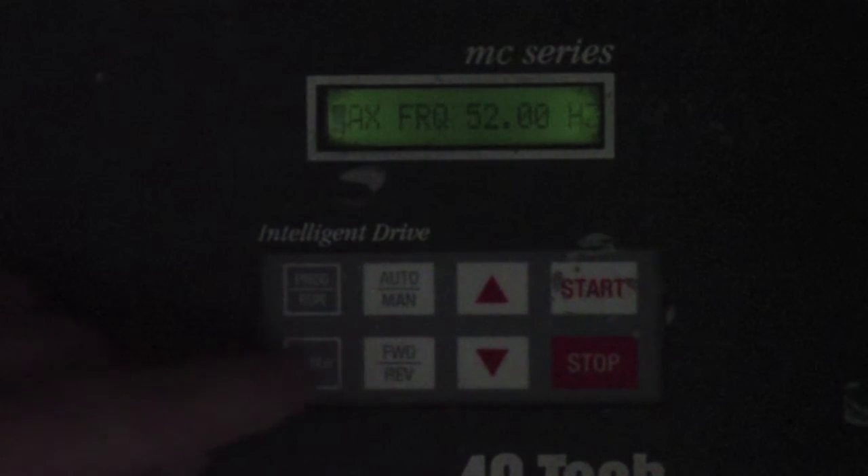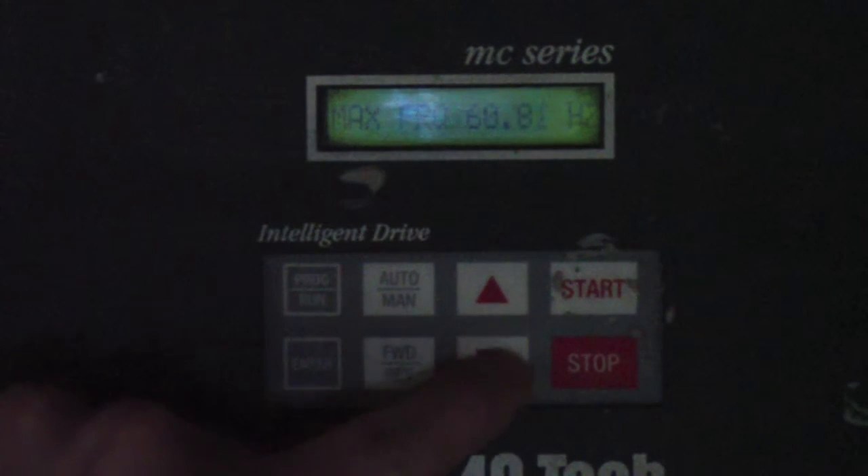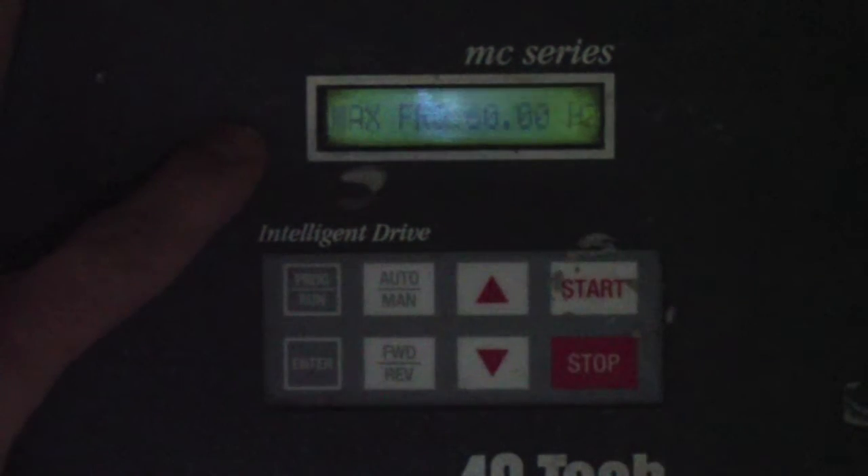Go ahead and hit the Enter key. The cursor will jump over to the right-hand side, and then press and hold the up arrow to increase the max frequency to 60.00 Hz. If you overshoot 60, just use the down arrow to bring it back down to 60.00. Then press Enter. The cursor will move back to the left, letting you know the max frequency parameter is now set to 60 Hz.